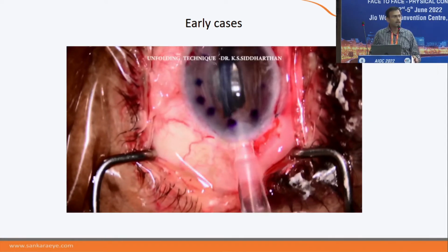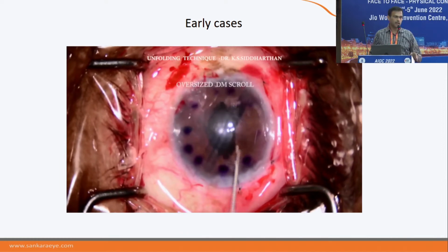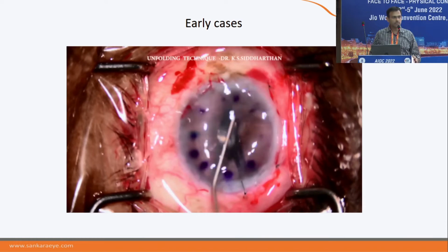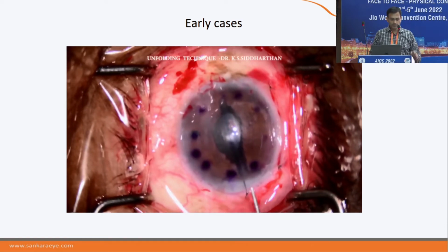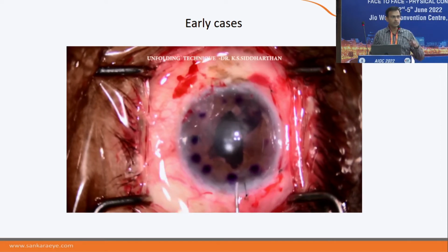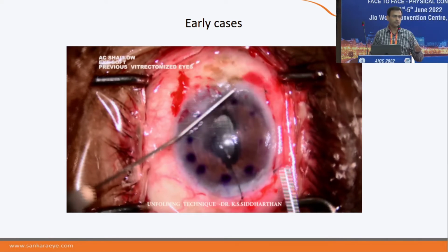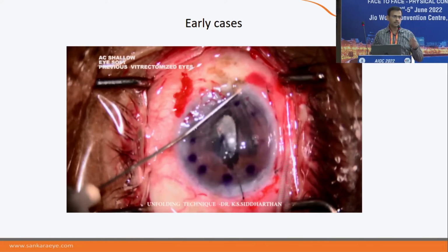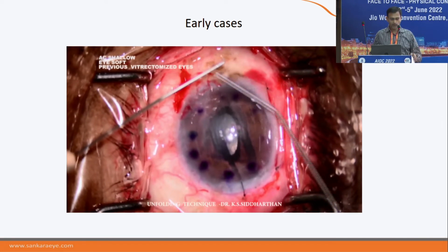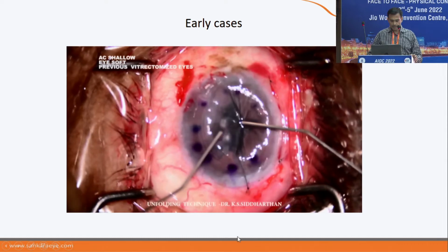And again, in early cases, don't take very young tissue of 35, 40 years and so on. Please don't take it. This is a video which I am showing you of what not to do with a young scroll. This is actually an iris claw, vitrectomized eye, a very soft eye. So don't try all these things in your initial days. After you practice, start with tissue of around 50 to 60 years, clear cases with a good pseudophakic in-the-bag IOL and so on. Otherwise it's going to be really tough to practice this.